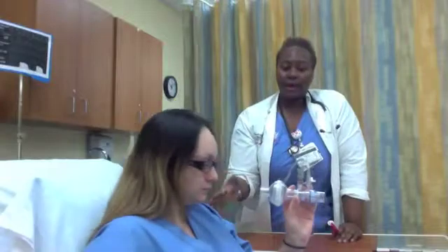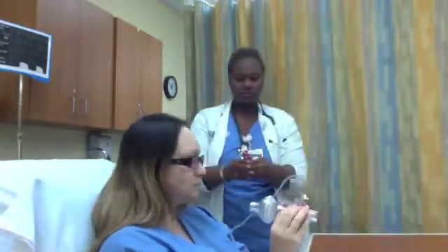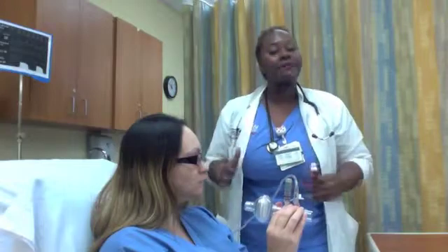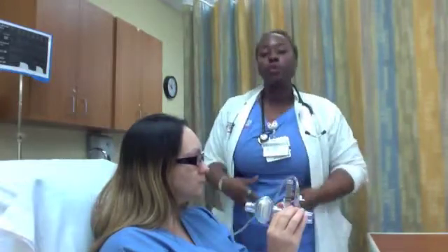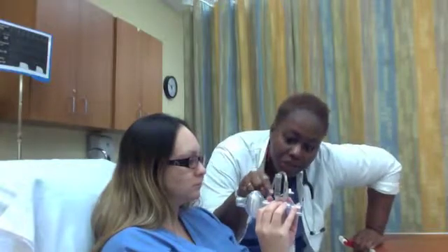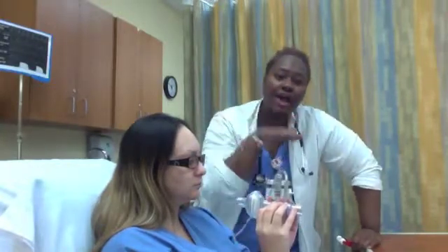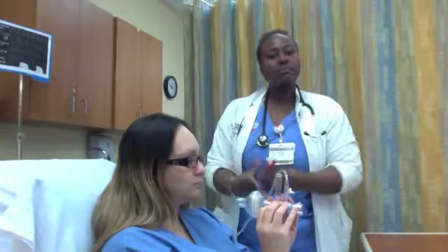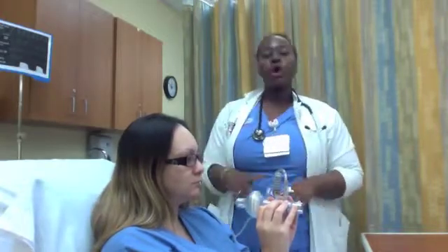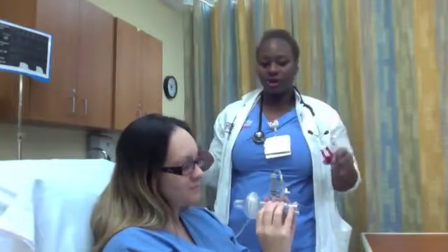My patient is sitting upright — notice that she's comfortable. The patient is going to inhale using their diaphragm. However, they're not going to take a total lung capacity inhalation, but it will be a strong inhalation using the diaphragm. Then she's going to exhale. While she's exhaling, I'm going to monitor the pressure manometer, and I'm going to make sure that her exhalation time is three times more than her inhalation time. After that, she does about 10 to 20 breaths, and then takes three huff coughs. She should do this procedure about 4 to 8 times within a 10 to 20 minute time frame.